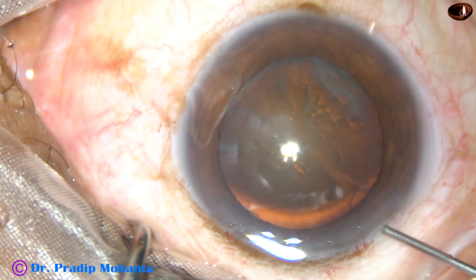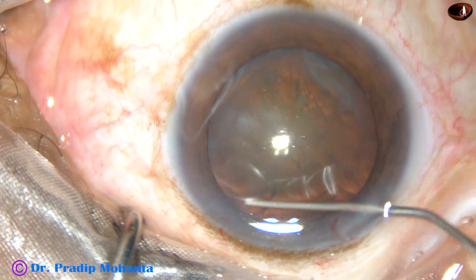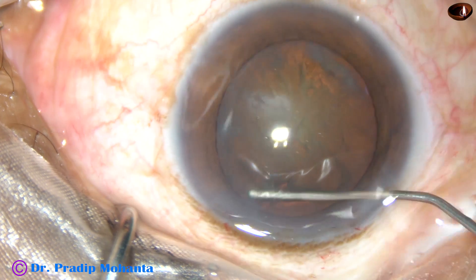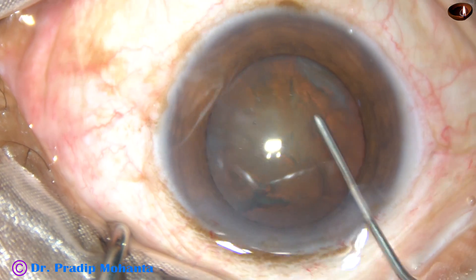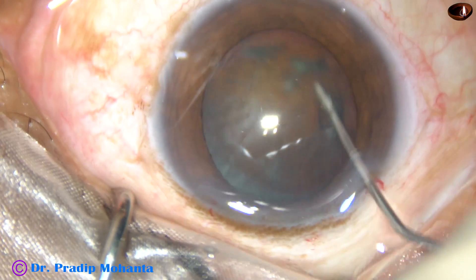And now, hydrodissection. I use a 27-gauge cannula and BSS for hydrodissection. The nucleus is mobilized and rotated.